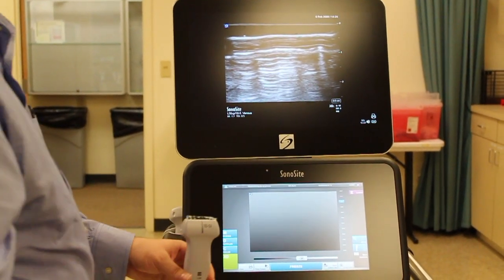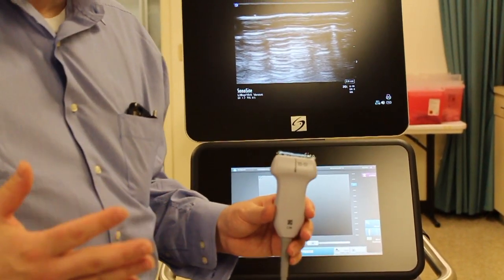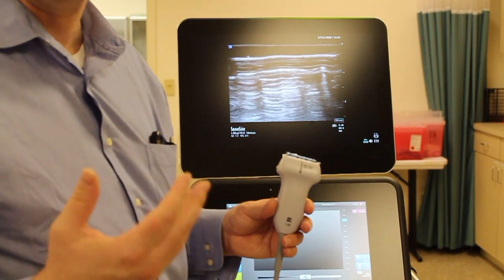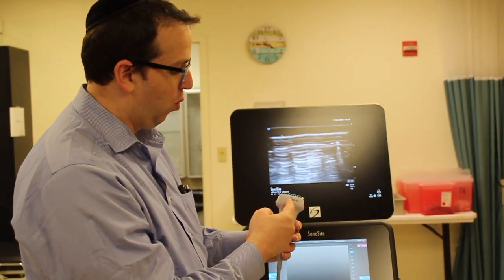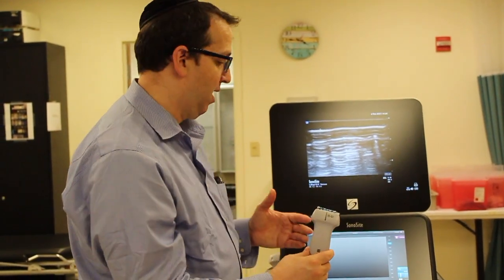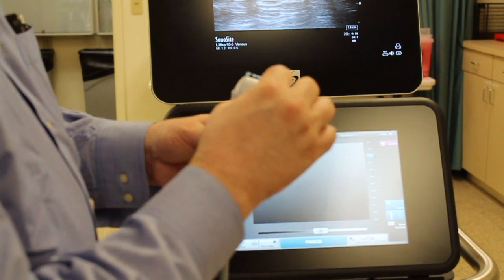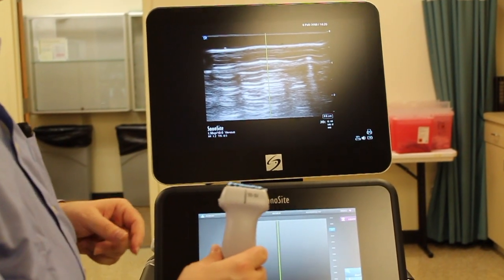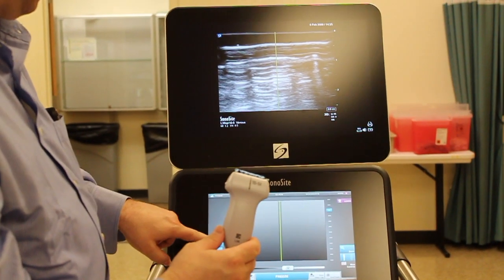I'll demonstrate the usefulness of color in just a moment when I scan myself. Lastly, for identifying structures when we want to use the ultrasound as part of a procedure — like putting a needle in or putting an IV in — we're going to want to align the midline of the probe with the midpoint on the screen. You can click the M mode and it'll drop a line down the middle of the screen, and that line corresponds to the exact midline of this probe. I'm going to go ahead and turn the M mode off.